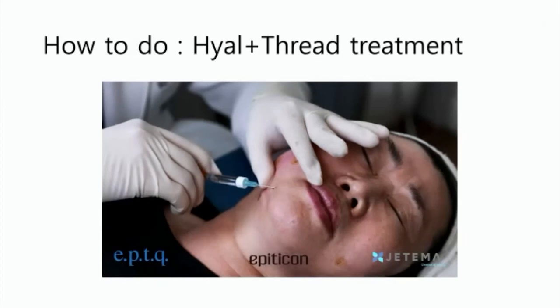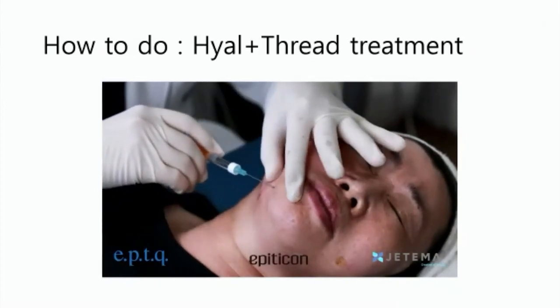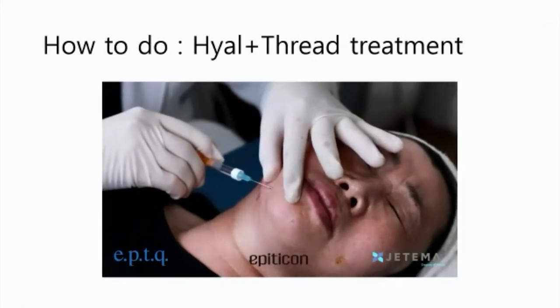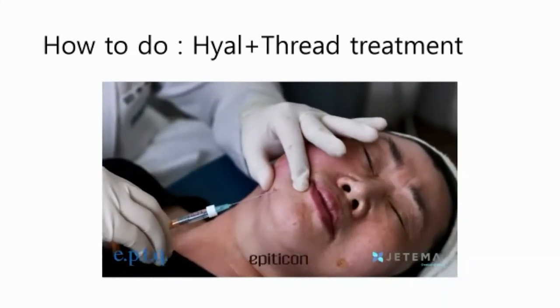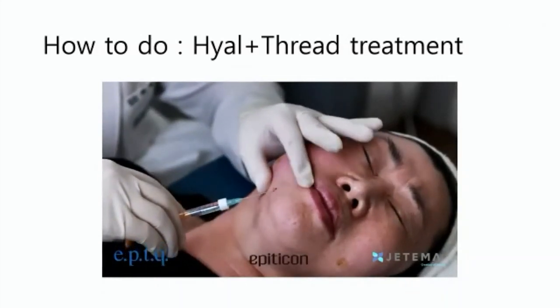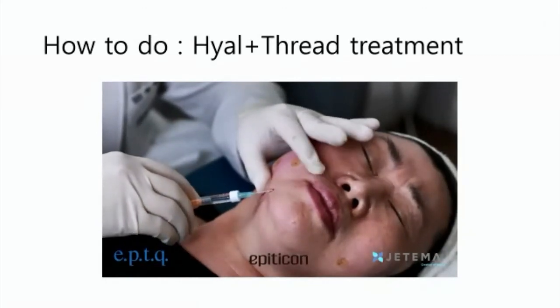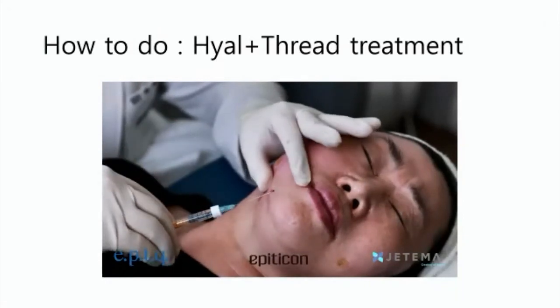So please use the cannula for this procedure for your and the patient's safety.